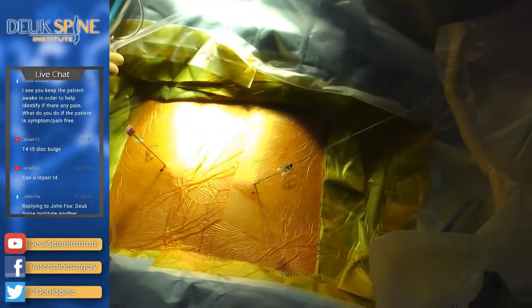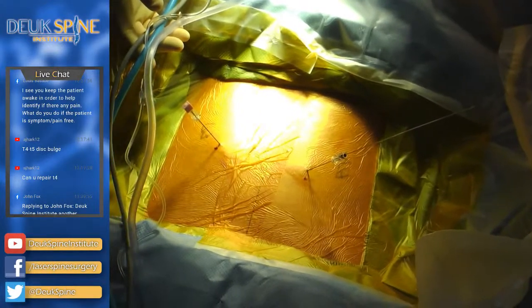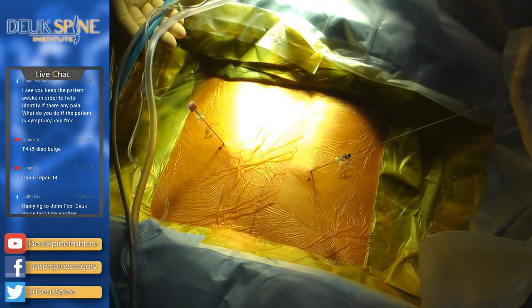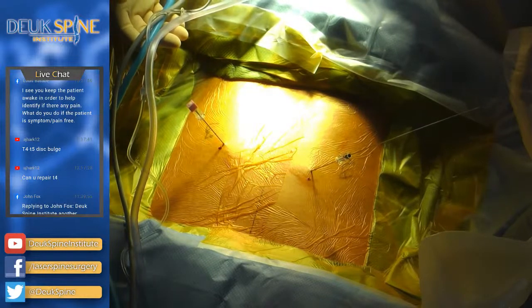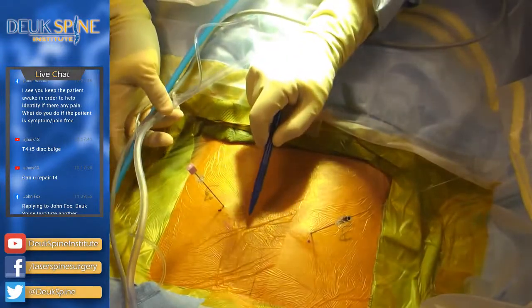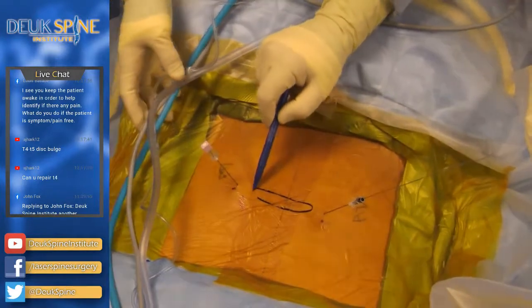But it's pretty remarkable. The patient was also offered surgery elsewhere, a fusion, with a massive transpedicular or lateral extracavitary transpedicular approach, where they would literally, can you guys see this, Sean? Let me see, yes, we can. And I'm going to show you the disc we're fixing. It's right here.